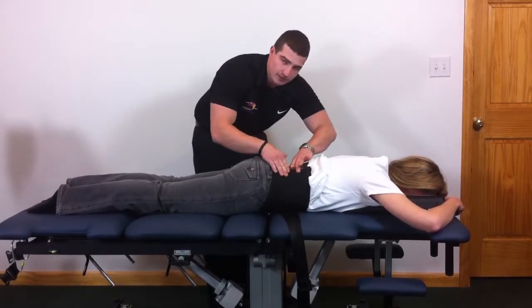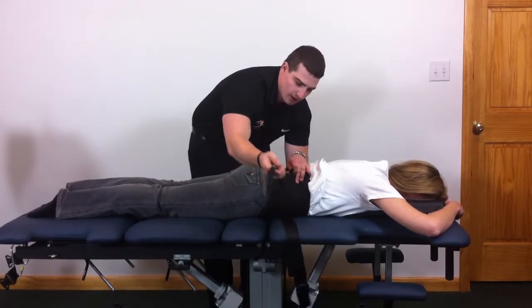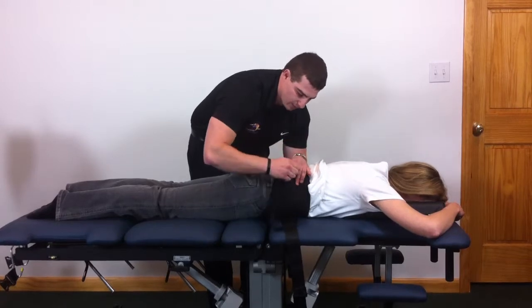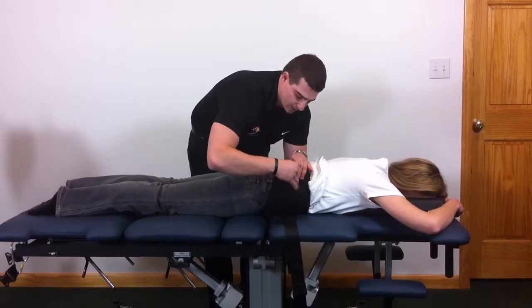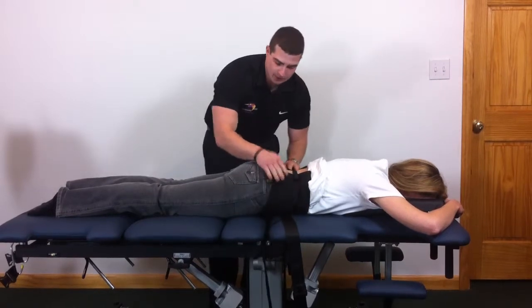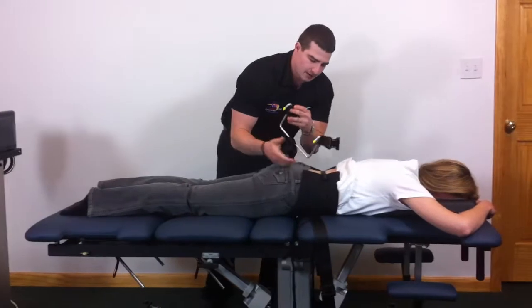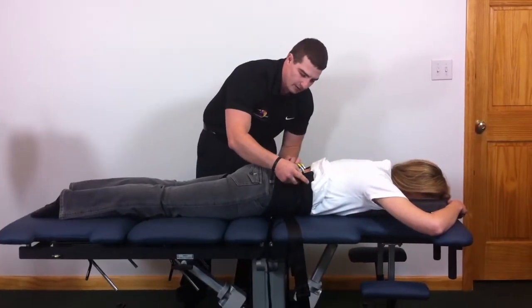You might have to fold this up underneath the patient as well. This secondary strap here is used to help you apply the belt. You just bring this up, connect it in, and cinch it down — it holds this up here for you. Then you reach down and grab this rail, bring it up, and set it on top of the belt.